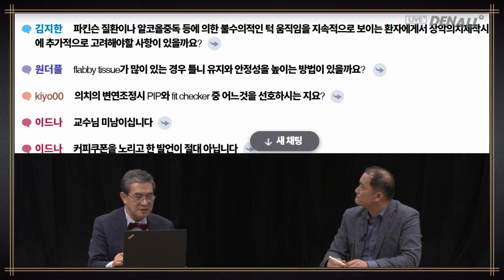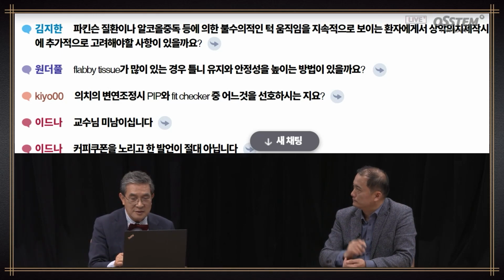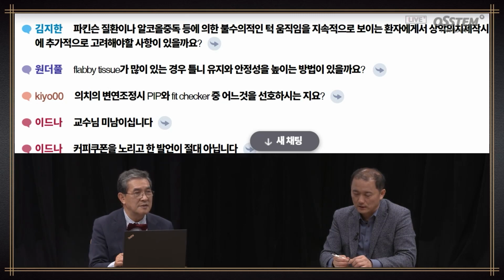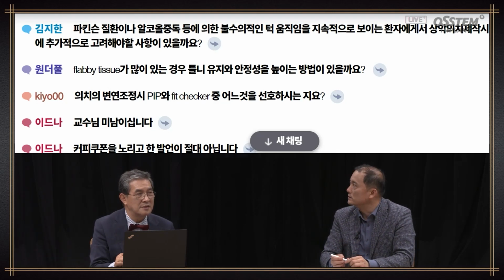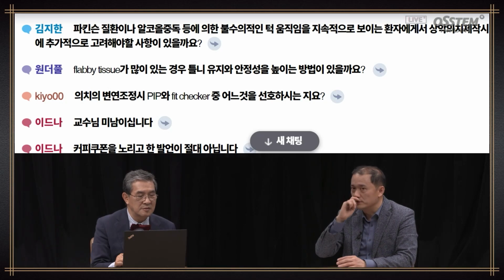So in creating an upper denture for this type of patient, is there anything to consider? Now, the jaw keeps moving, so the lower jaw might be more tricky than the maxillary side. I think with dementia or Parkinson's patients, due to the medicine they take, sometimes the load in chewing is put on too excessively. So retention-wise, without implants, you cannot guarantee it.